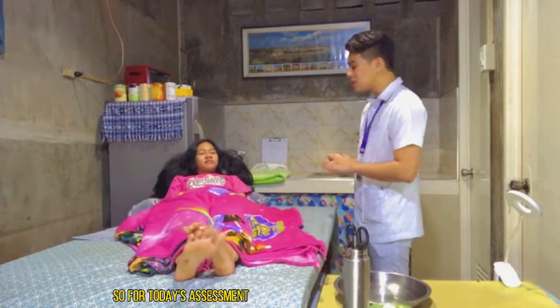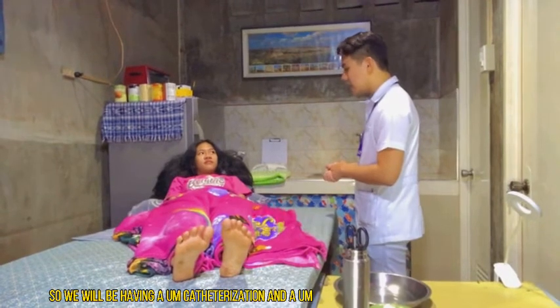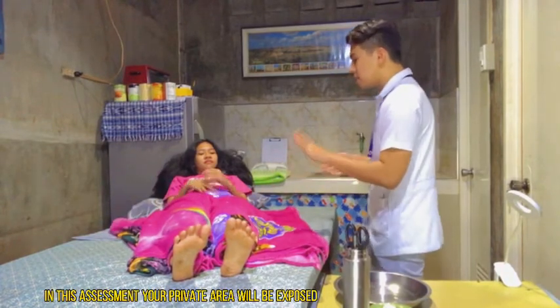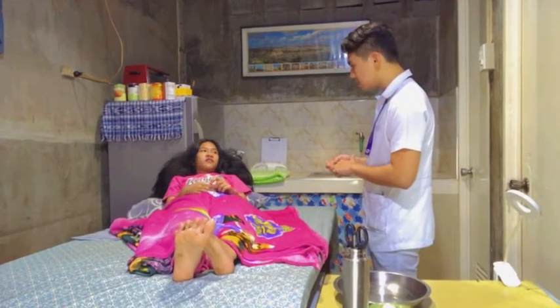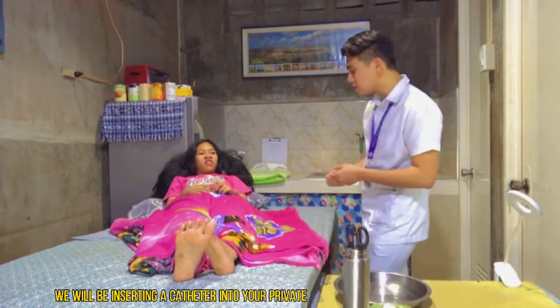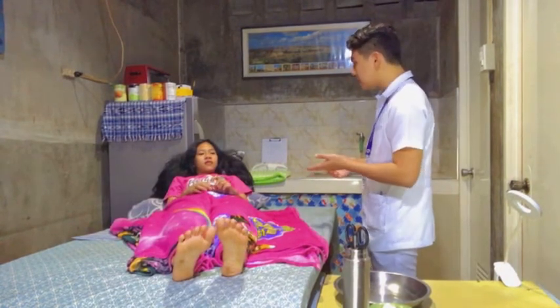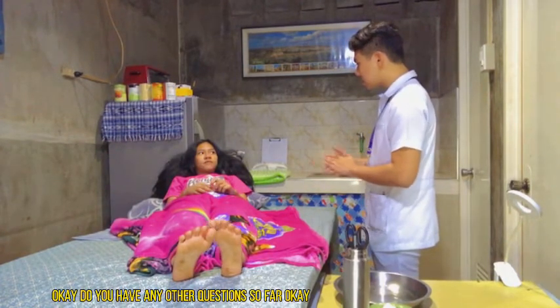one. So for today's assessment, we will be having a catheterization and a specimen collection. So for you to be informed, ma'am, in this assessment, your private area will be exposed. Would that be okay? Yes. Do you have any other issues aside from that? Okay. So upon exposure, of course, we will be inserting a catheter into your private area for us to assess the amounts of residual urine, because you cannot empty your bladder completely in accordance with the physician's order. Okay? Do you have any other questions so far?